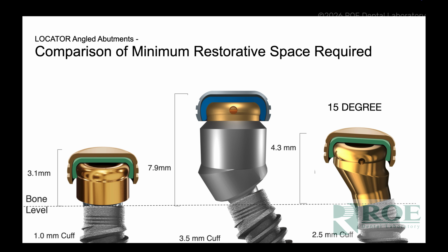Okay, so more recently, Zest has added angled LOCATOR abutments to their line of products. This picture shows the height of the straight LOCATOR abutment, and then it shows the angled abutment. Because of the way the angled abutments are, it requires a little bit more restorative space.